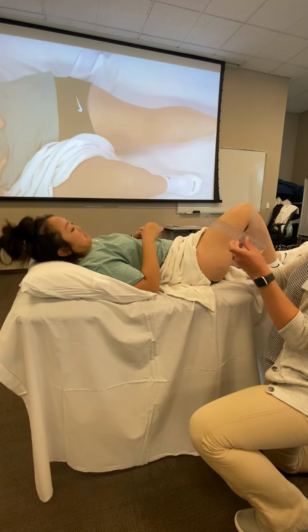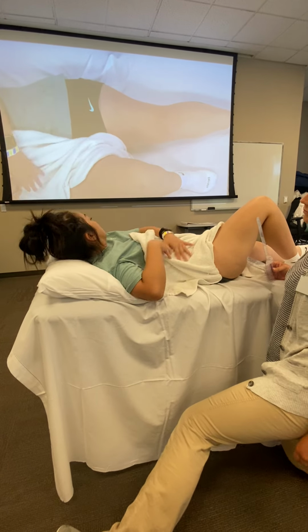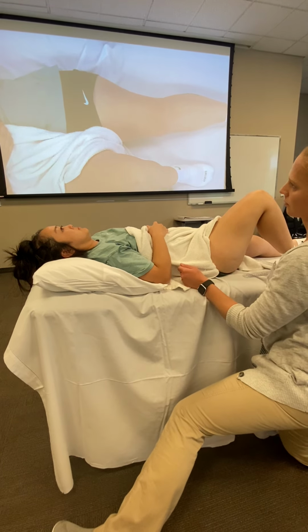This was stopping though. No, I'm sorry. A lot of your total hip patients, after you're cleared to go through bigger ranges of motion, they'll be tight muscularly. Yes. So that would be a situation you would definitely get like a firm end feel, but again, that wouldn't be normal at that point.